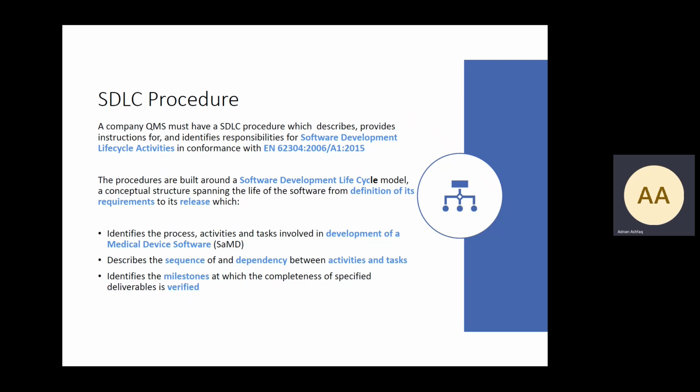So one of the other things is that the company implementing the software development must have an SDLC, a software development lifecycle procedure, and it must describe and provide instruction for, and identify responsibilities for, the software development lifecycle activities in conformance with the standard.